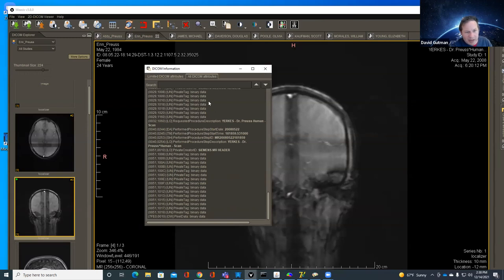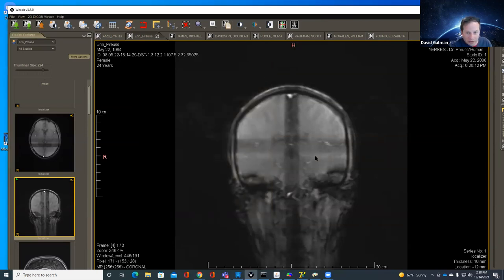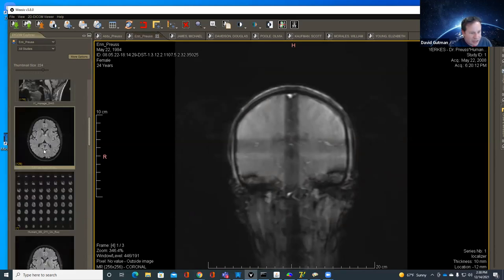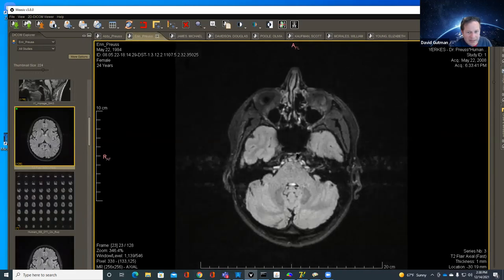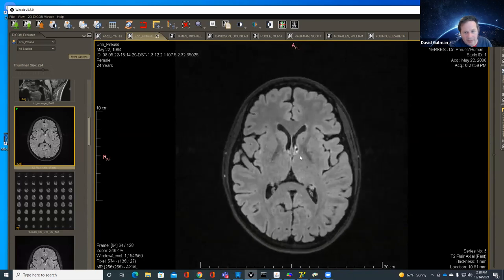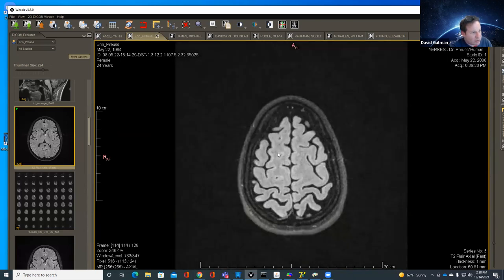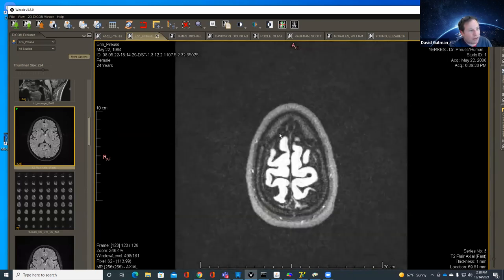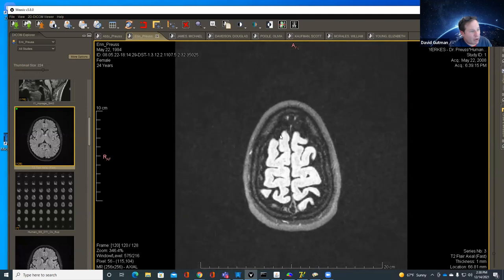For this part of the demo, all I wanted to show was opening up some images and looking at them. The first thing of the due diligence is actually seeing the images. In my case, going through my T1s, I actually don't see any burnt-in text. That would probably be the first thing I'd want to do, and it would affect what downstream tool I'd want to use for the next phase.